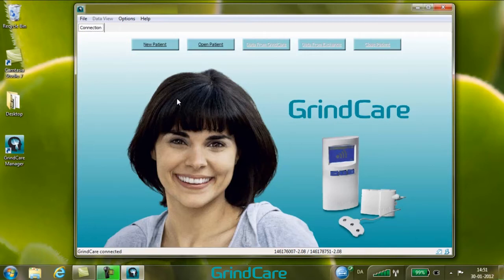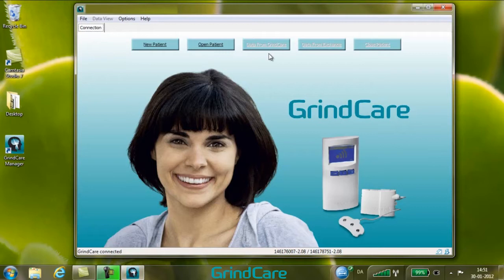The buttons on the main screen are: New Patient, where you create a new patient; Open Patient, where you open an existing patient file; and Data from GrindCare, which is used for appending data from the connected GrindCare device to the active patient file.